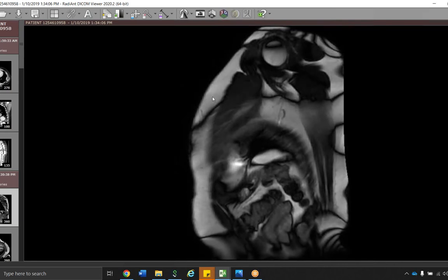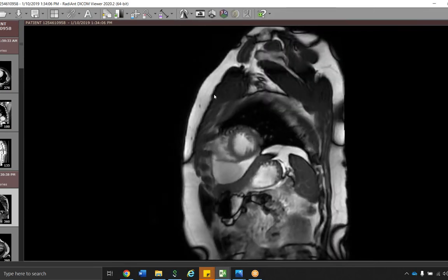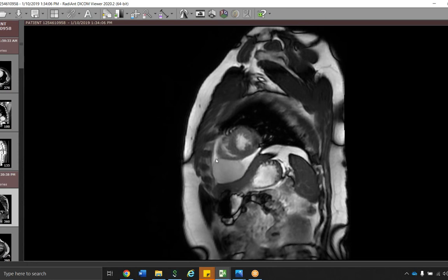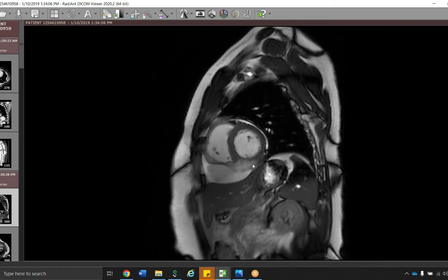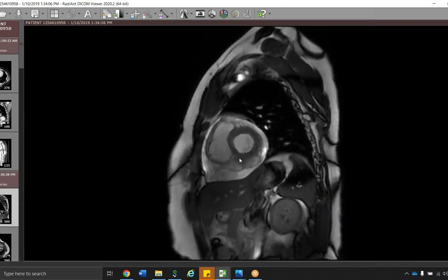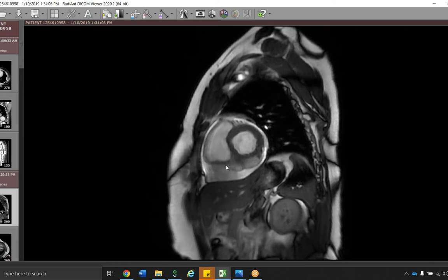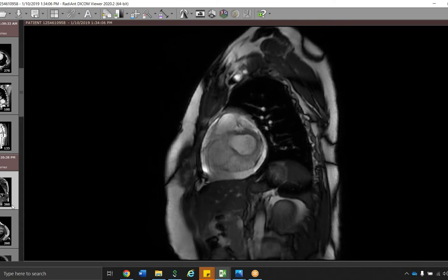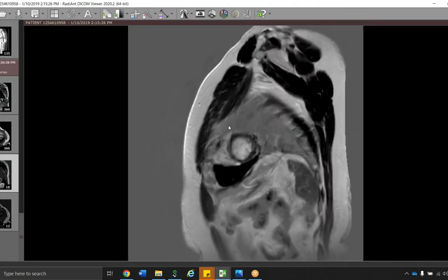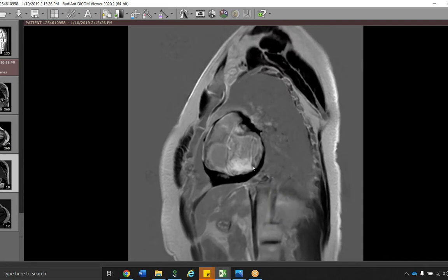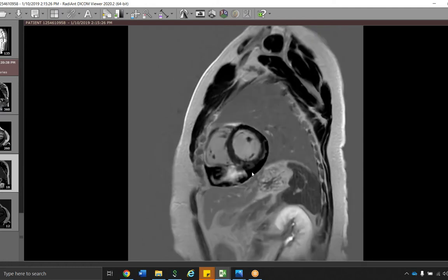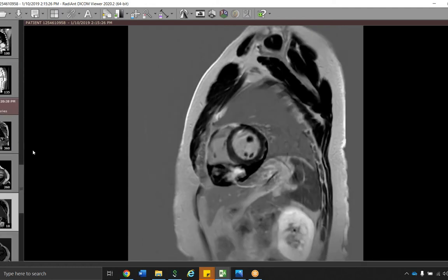We also did an MRI to confirm this. Scrolling through the short axis cine, we see an intrinsically bright lesion within the pericardium as well as pericardial fluid. Coming further back toward the base of the heart, there are additional areas of intrinsically bright soft tissue invading into the myocardium — going along the wall of the ventricle, between the ventricles, and underneath the wall of the right ventricle, all the way to the base. This was all brightly enhancing on delayed imaging, very suspicious for intracardiac metastasis from a liposarcoma.